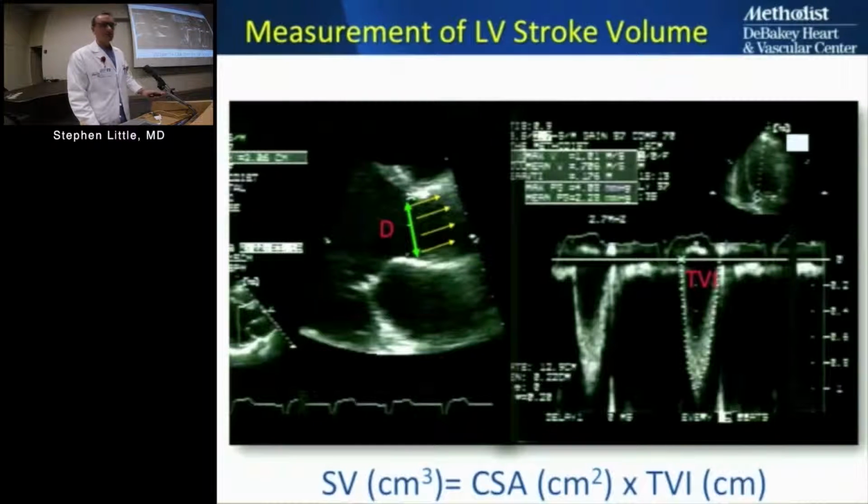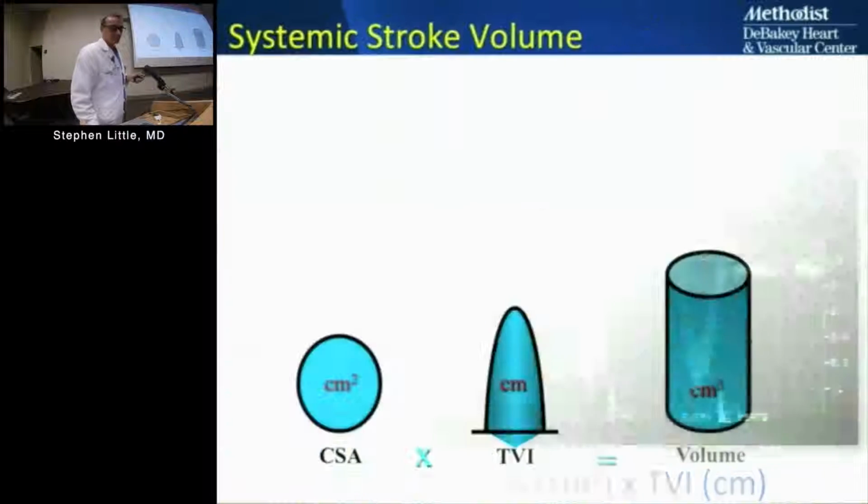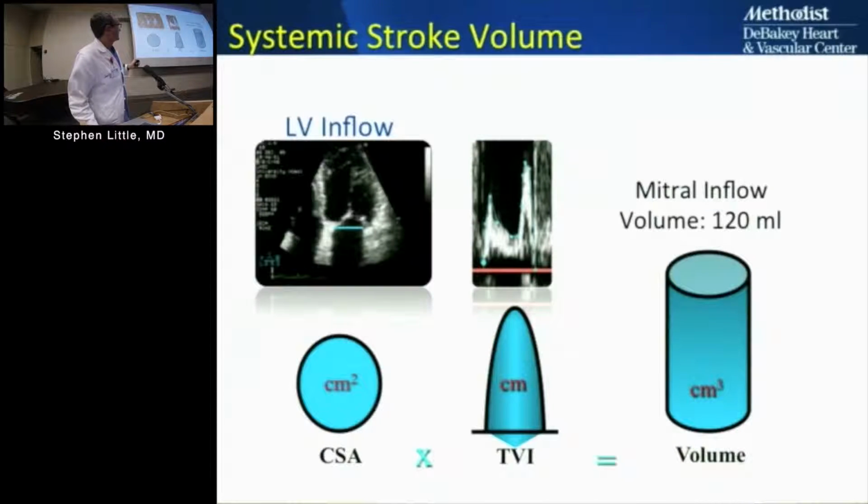The old standard, of course, is quantitative Doppler. We've seen this in many settings. It's basically area times distance equals volume. Area in, distance traveled in, equals volume out. As I mention each year when I give this talk to the sonographers and the new fellows in the lab, it's definitely worth pairing with the sonographer and asking them, in several patients who don't have MR, to get a pulsed-wave sample volume at the annulus, so that you can go through and do the math with an internal control.